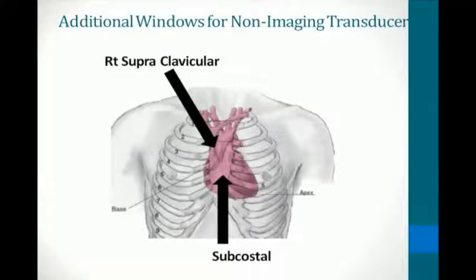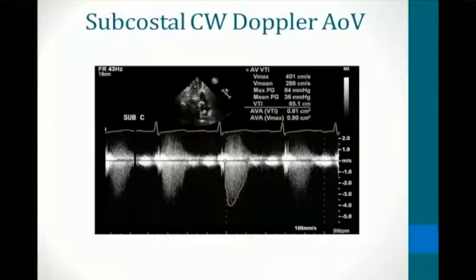For this one, it can be very challenging to find and may need additional pressure for proper angulation. The narrow opening of the aortic valve creates a smaller jet to find, and it's not always in the center of the valve. It helps to use some off-axis imaging to really find the highest velocities, so be adventurous and think outside the box with positioning and angulation of the non-imaging transducer.